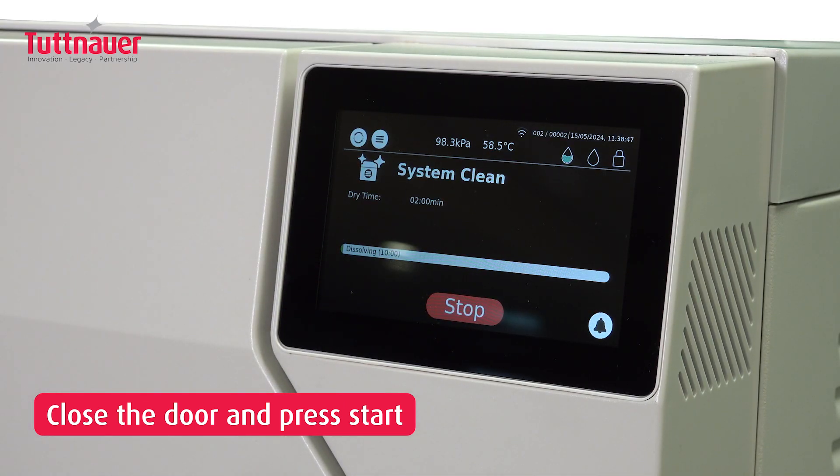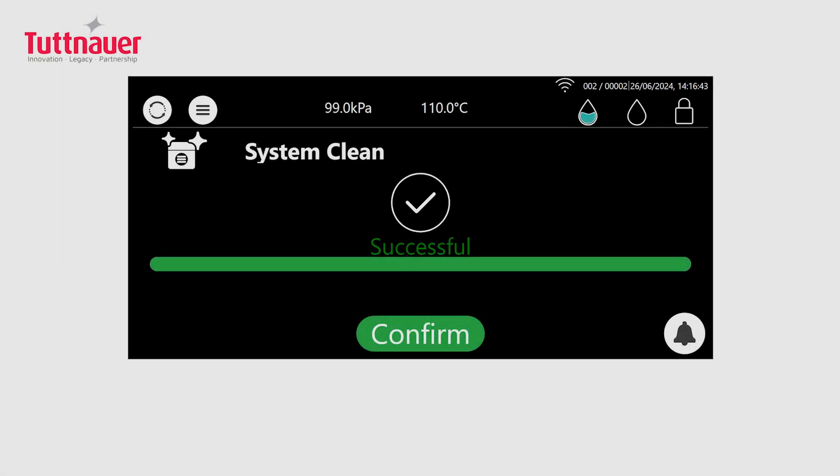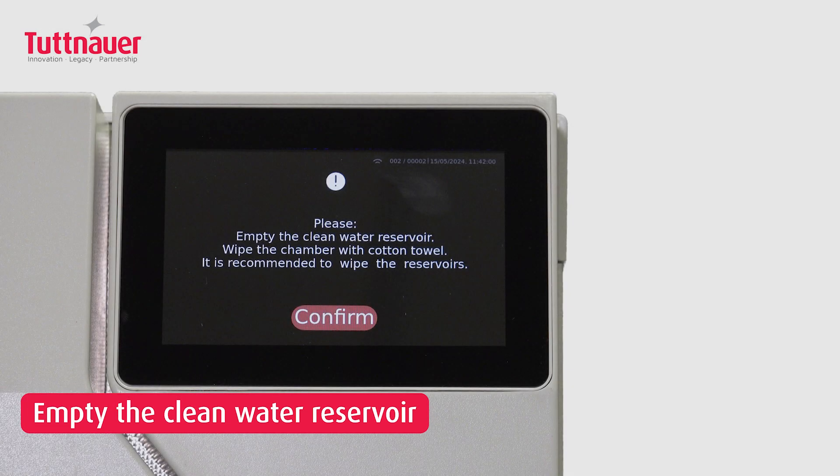The cleaning cycle begins now. After the cycle finishes, confirm the prompt on the display to start the cleaning completion steps.